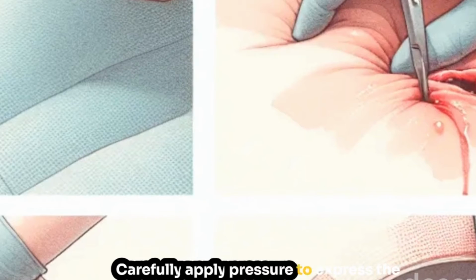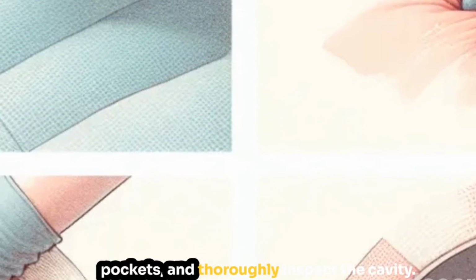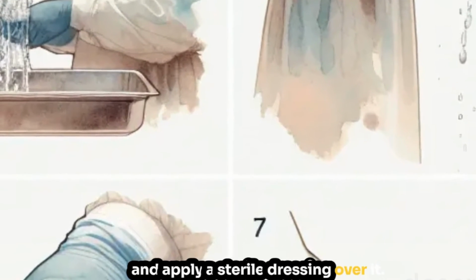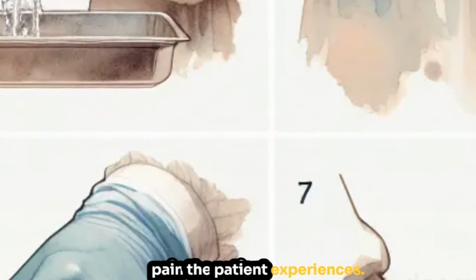Carefully apply pressure to express the pus, use hemostats to break up any trapped pockets, and thoroughly inspect the cavity. If necessary, obtain a culture. Rinse the cavity with saline until it is clean, insert gauze to loosely pack the wound, and apply a sterile dressing over it. Additionally, manage any pain the patient experiences.